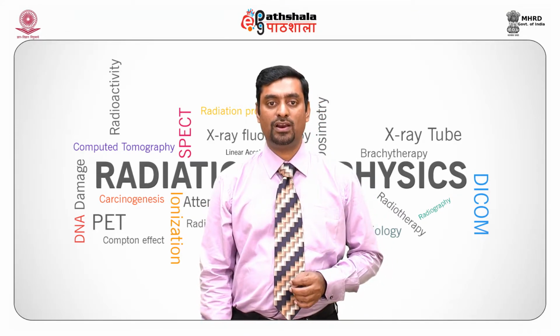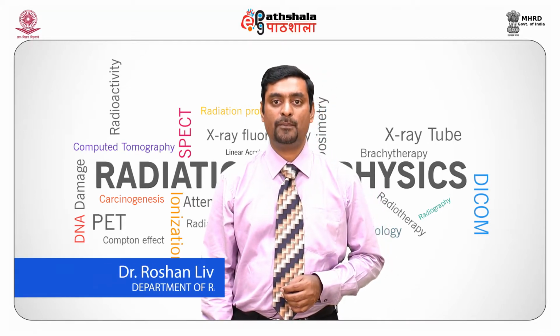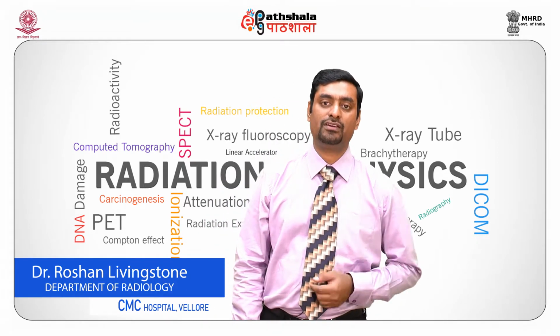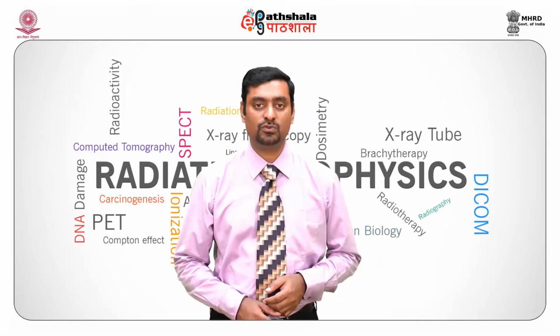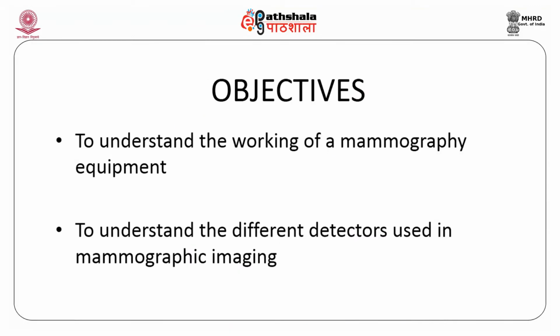However, it is also required to keep radiation doses as low as possible because breast is a radiation sensitive organ and there is a risk of carcinogenesis associated with the X-ray technique. So what is the basic objective of the study? To understand the working principle of a mammographic equipment, and to understand different detectors used in mammographic imaging.